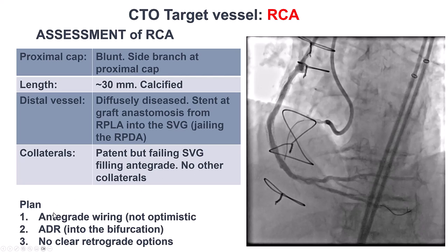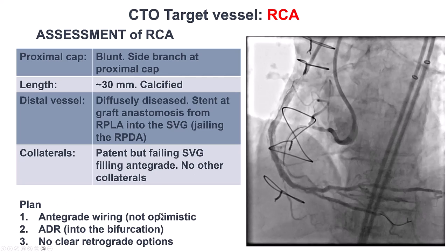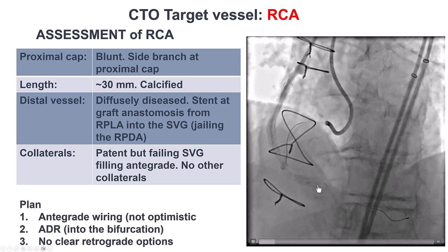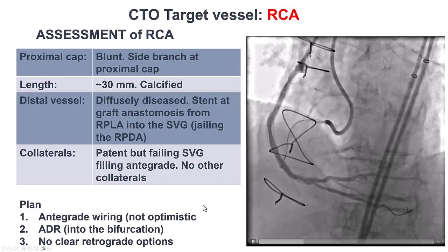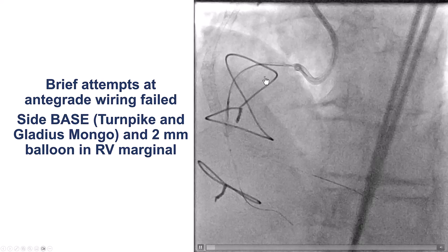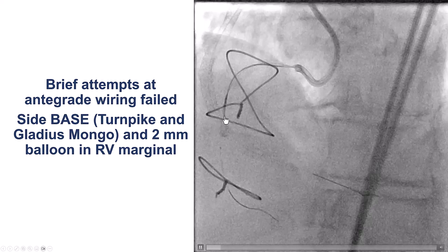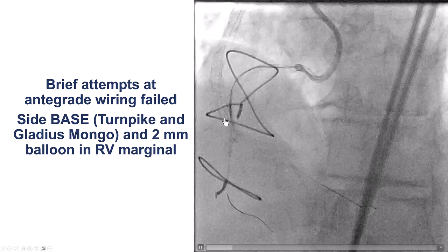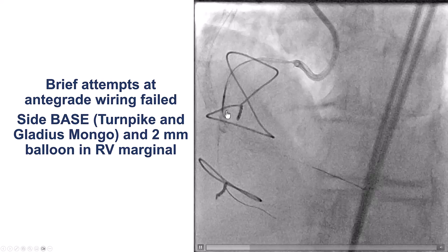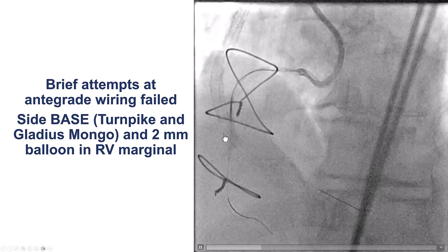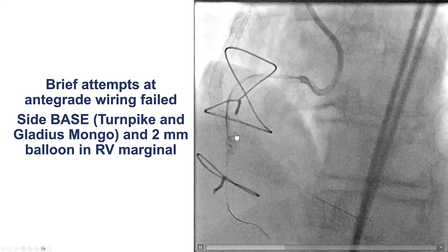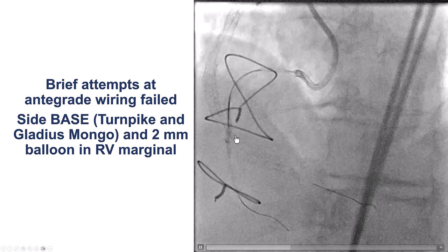Our plan here was to go antegrade with wiring or ADR, going before the bifurcation for the reentry, as retrograde was unlikely to work. We did several attempts for wiring antegrade, but that did not work. We then placed a balloon in the marginal branch at the proximal cap, and after doing that, we were able to knuckle.